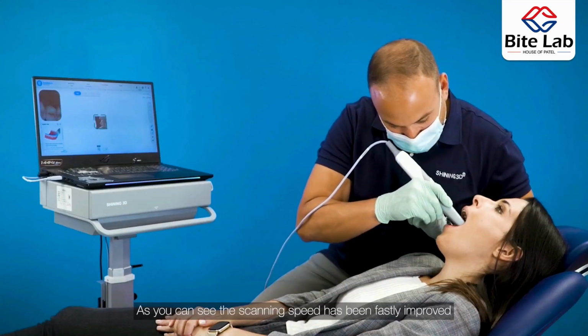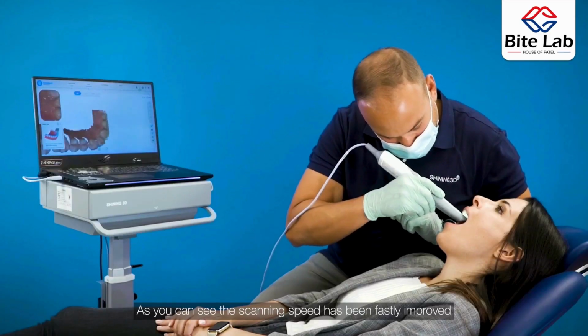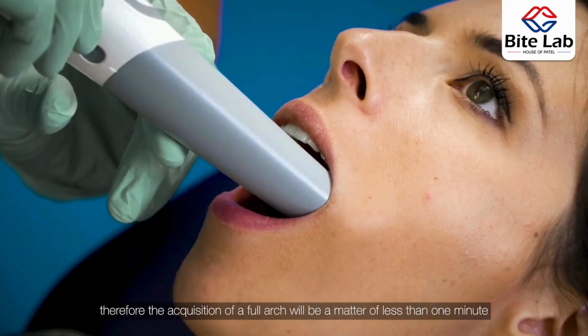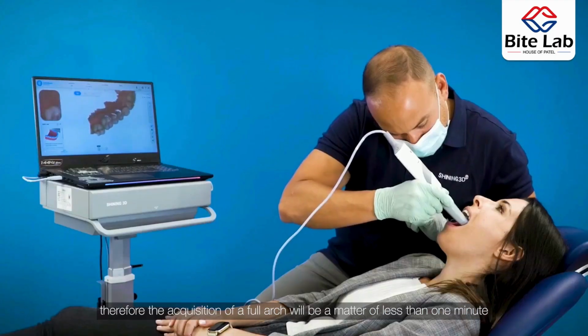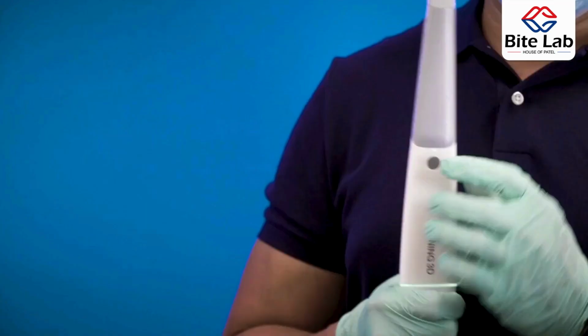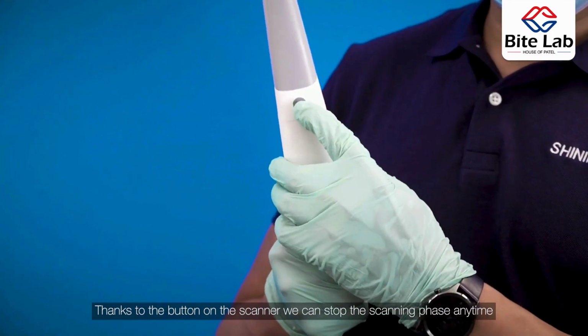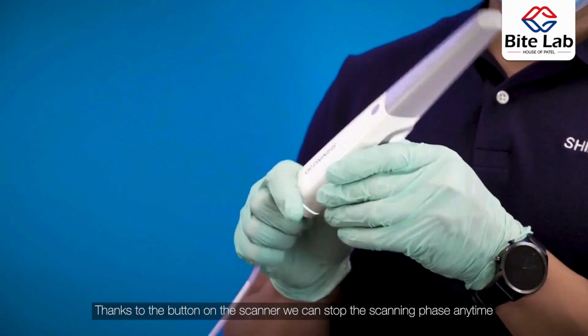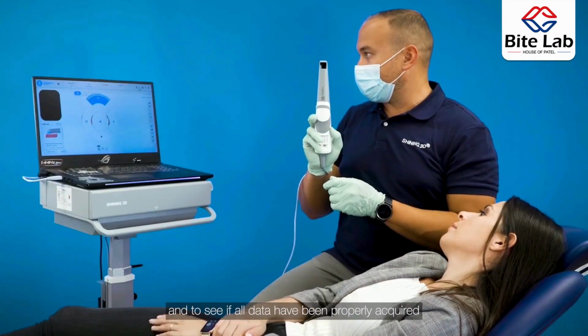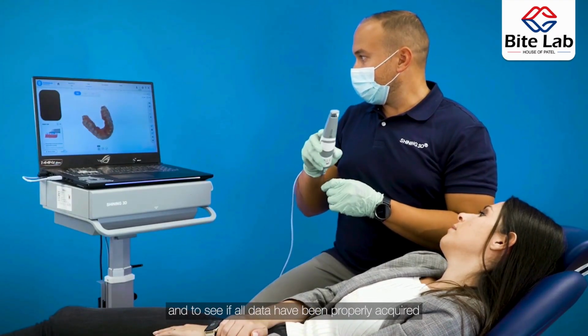As you can see, the scanning speed has been drastically improved, up to 30% faster now. Therefore, the acquisition of a full arch will be a matter of less than 1 minute, even for the least expert users. Thanks to the button on the scanner, we can stop the scanning phase anytime to check the quality of the acquisition and to see if all data have been properly acquired.